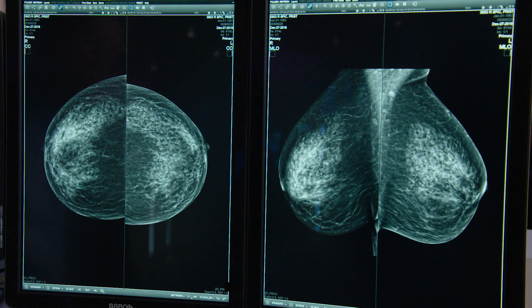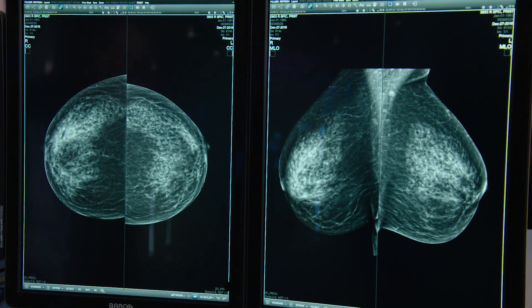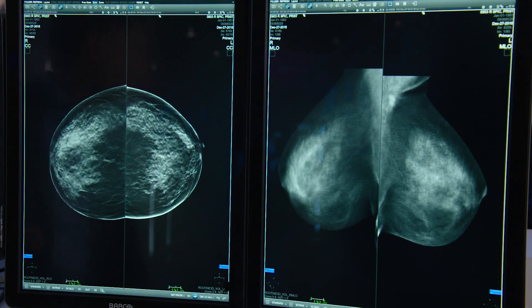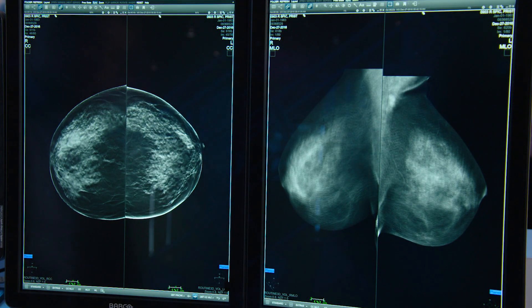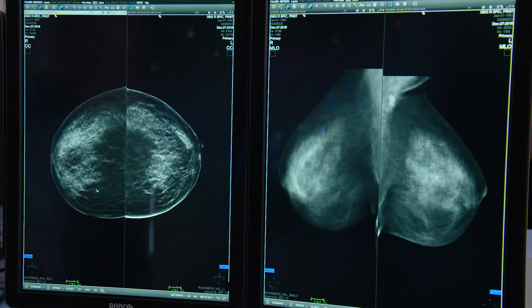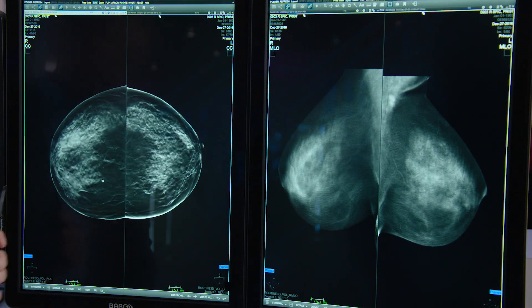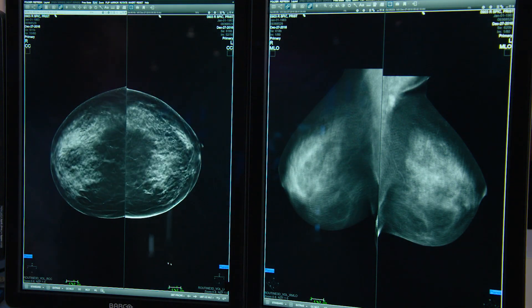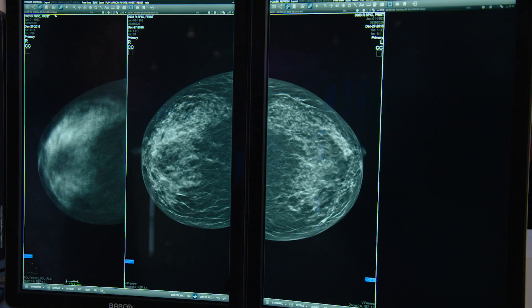As a first layout you can see, for example, the set of four images — the recent 2D images. The next step might be comparing them against your priors. Next, we're pulling up the tomo images with specific tools indicating where you are within the stack. You can activate the scroll feature, even synchronize left and right, and move on with your diagnostic exam.